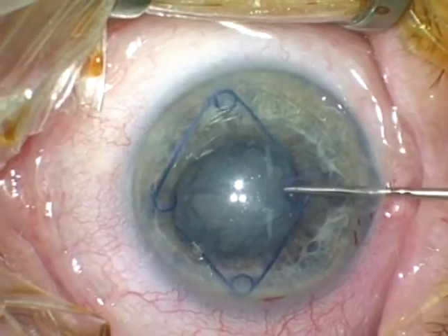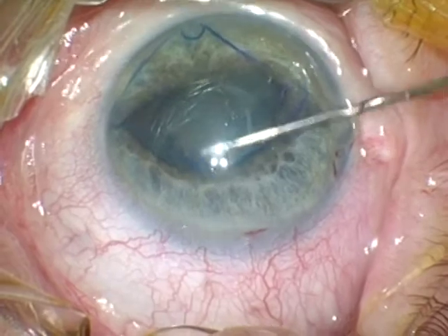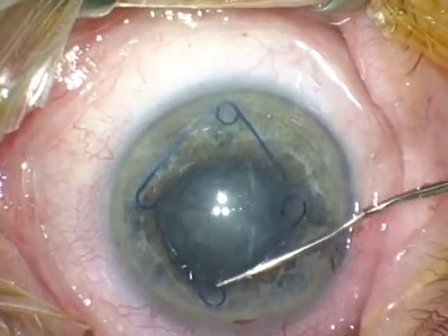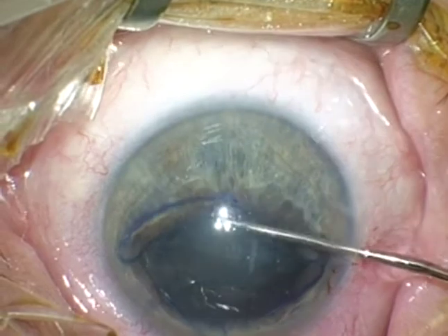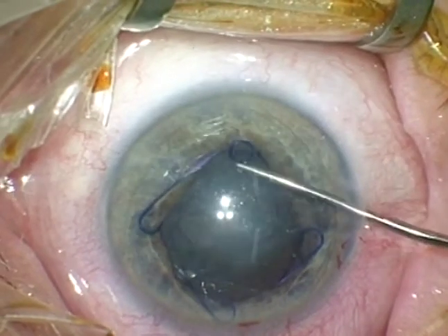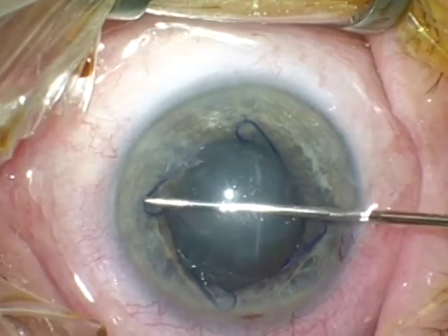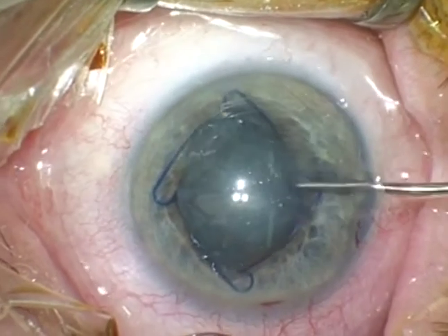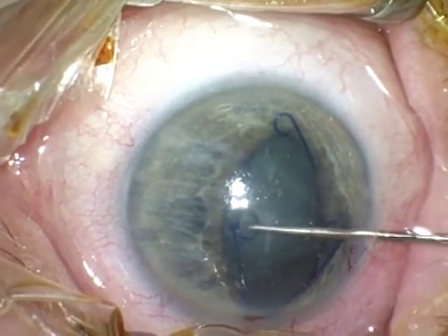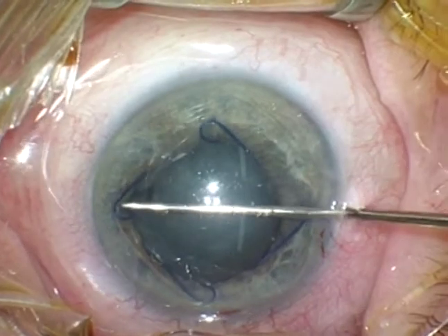I disengage the device from the injector and, utilizing the manipulator, catch the iris margin in order to fixate and expand the pupil. Again, we have to be quite careful in order to avoid catching the capsulorhexis edge, which can be easily done by the scrolls of the device. So you have to have a look at the mobility of that device, and if there is any place of movement restriction, then this will give you an idea of whether or not you are catching the anterior rhexis, which happens in that case with the scroll located contralaterally to the main incision.